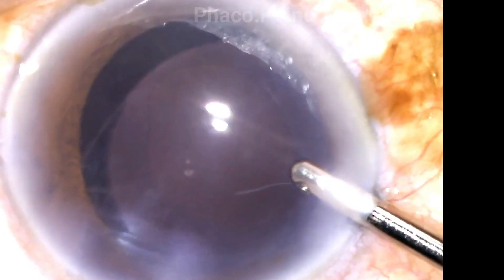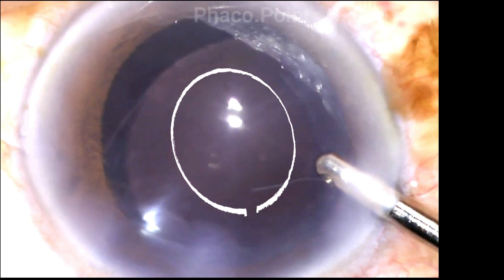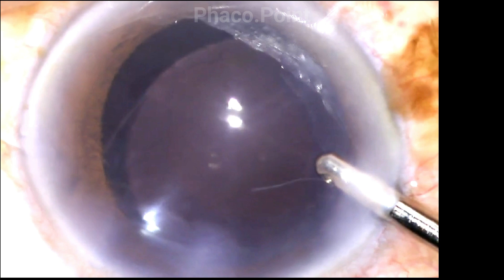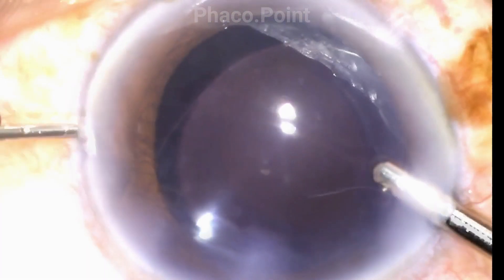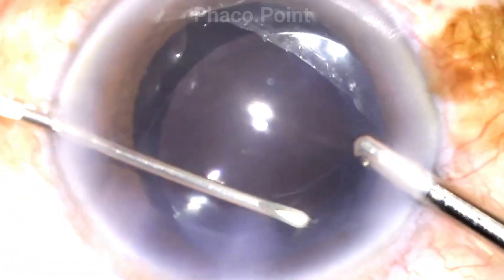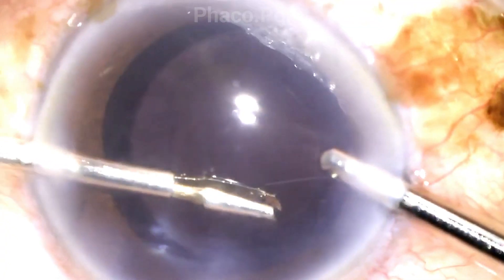Following the IOL insertion, we now visualize what the capsulorexis looks like. Clearly you can see a sub-optimally sized rexis, so we now consider enlarging it. The points to take into consideration prior to enlargement are as follows: making a nick in the anterior capsule while the nucleus is still in the bag versus over an IOL are extremely different experiences. In the former case, we tear the anterior capsule taking support of the underlying nucleus; when tearing the rexis over an IOL, there is no such support. There is often a gap between the anterior capsule and the IOL because of the overall thinness of the IOL, and this lack of support can make creation of the initial nick sometimes rather challenging.